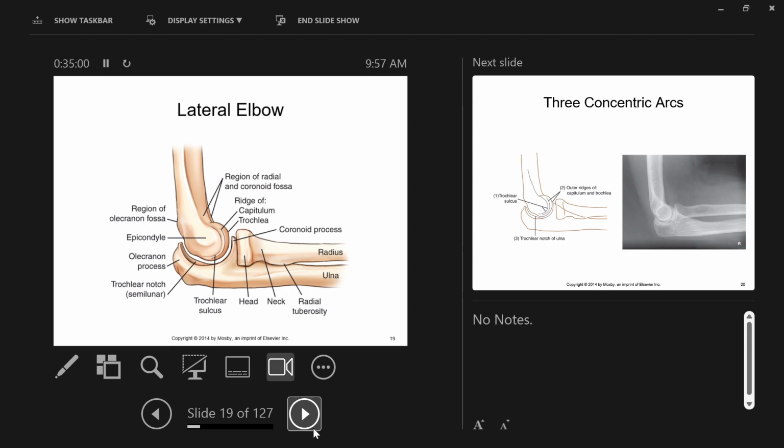If the person is positioned in the true lateral, and of course we're looking at it from the side right now, where their humerus and forearm are both parallel to the tabletop, okay? We'll see this, pending you're doing all the other positioning things that I'm not saying, but I am showing, pending you're doing all of those correctly too.